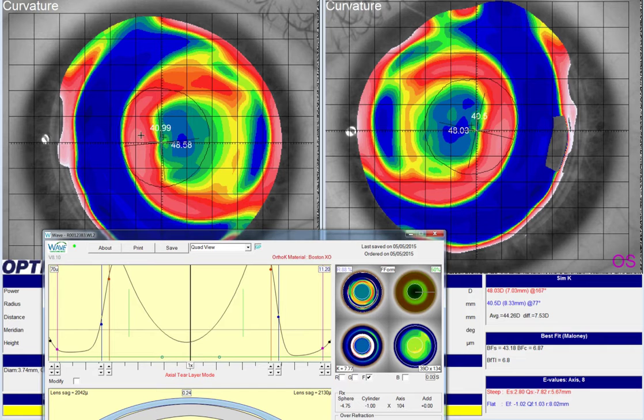There's a lot of molding going on here, and it's possible that this super flat area will cause some unusual decentration of a different lens design.